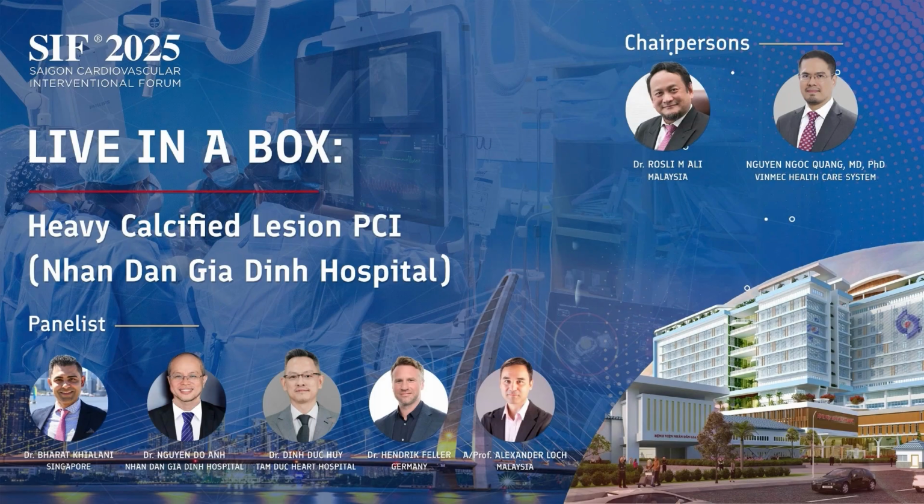I still got one more question for you. If you look back at the procedure again, if you start again, should we do the IVL for the left main, or should we just do it for the LAD and leave the left main without touching it? Actually, I really want you to touch the left main, because you see the heavy calcification on the left main also.